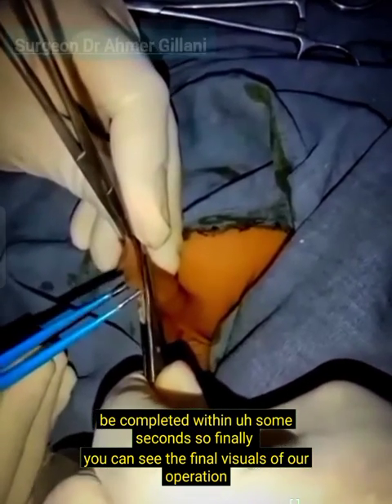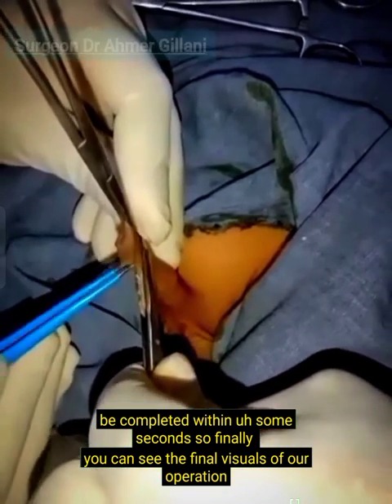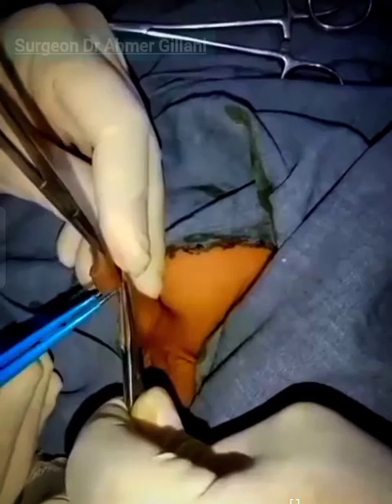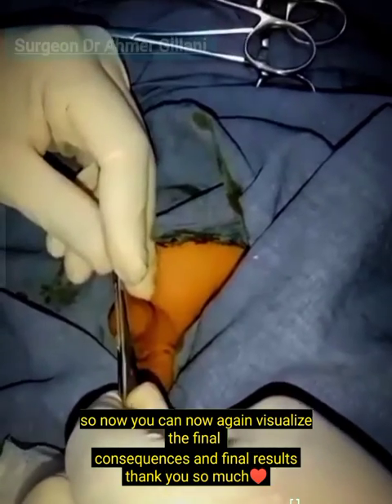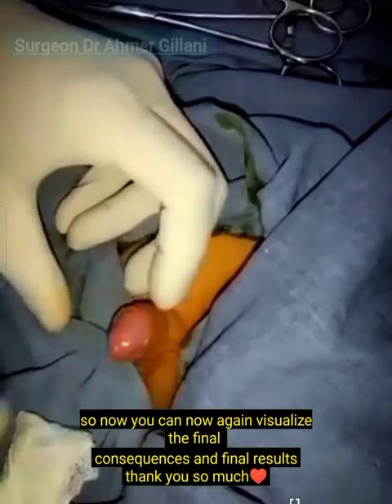Finally, you can see the final visuals of our operation. Now you can again visualize the final results. Thank you so much.